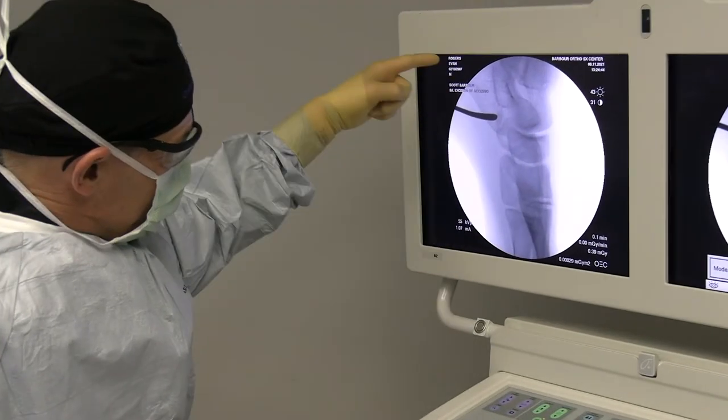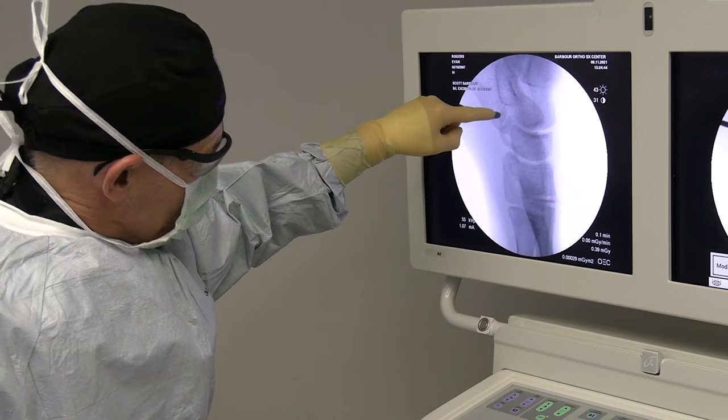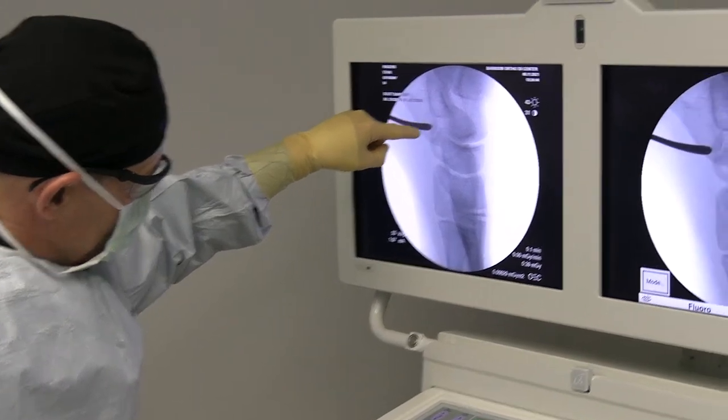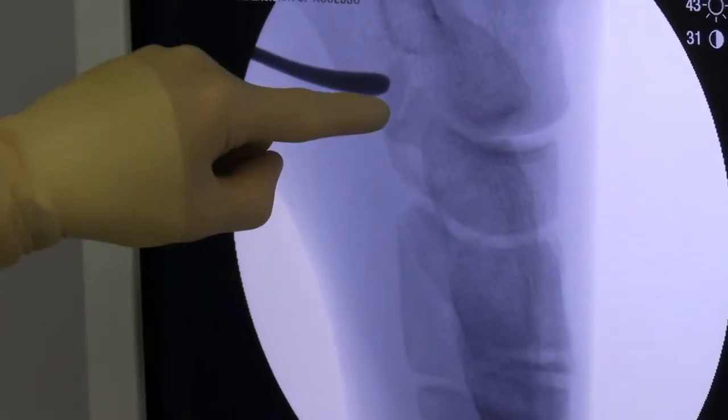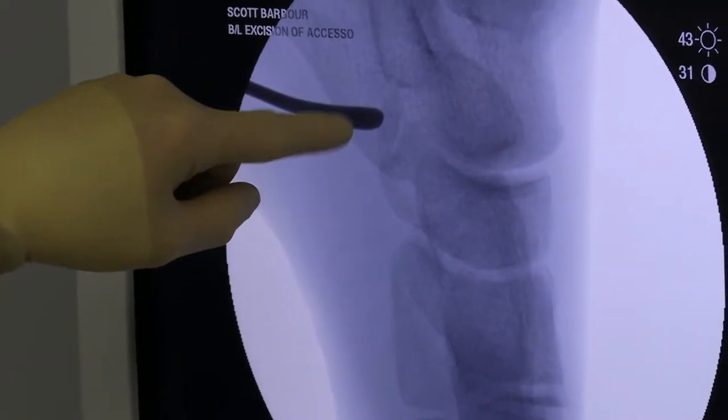His foot is pointing down this way. The heel is up here, and my pointer is right on this little bone — right there is an accessory navicular. You can almost see it's got kind of an abnormal joint to connect it to this bone called the navicular. So this thing is just causing him a lot of trouble.